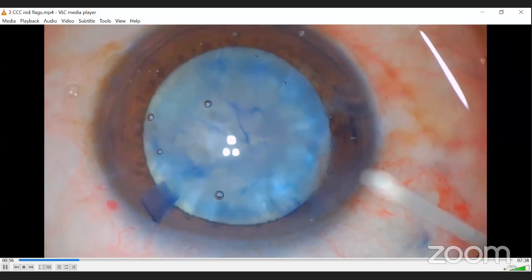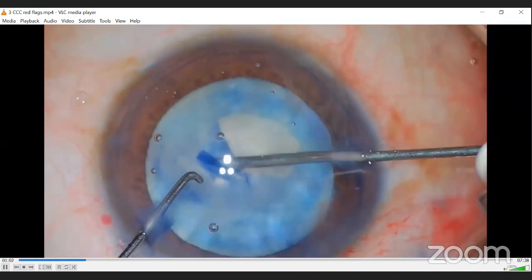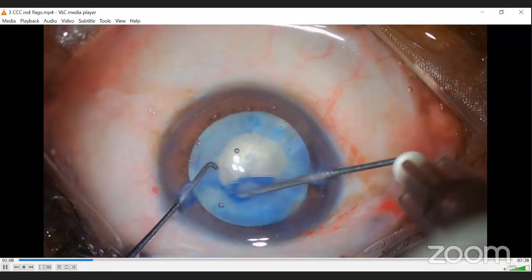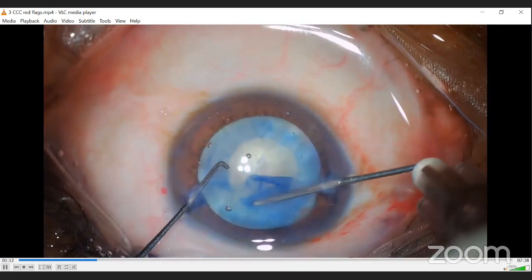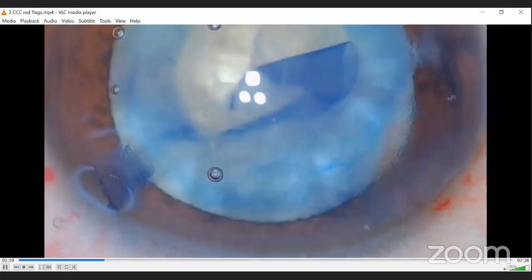So the anterior capsule is flat now. And now I'm going from the side port to do the rhexis. Quite easy now as compared to initially because now the lens intumescence is less, but still keep watching the Capsulorhexis edge. Okay, what do you see here? You can see the Capsulorhexis edge has changed its direction. So this is one red flag.